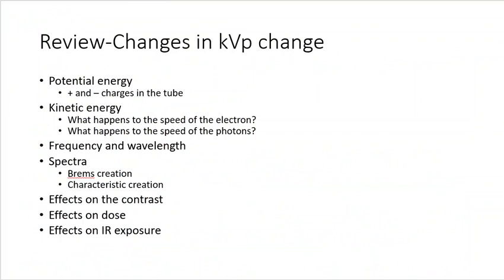So what are the effects of kVp on contrast? As kVp increases, we get more penetration through the patient. That gives us less differential absorption.